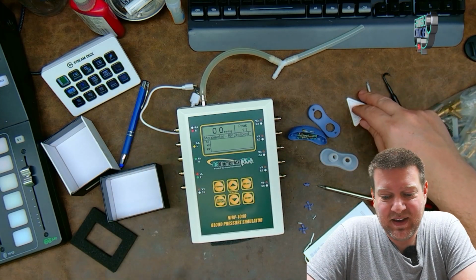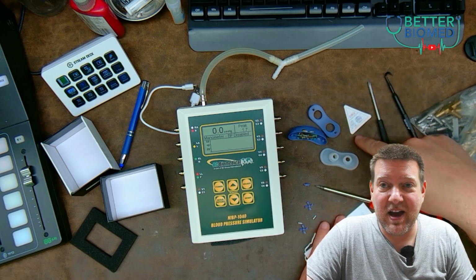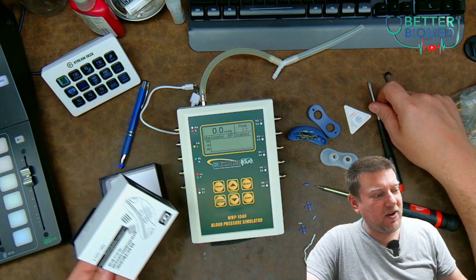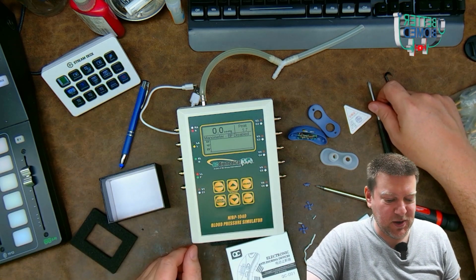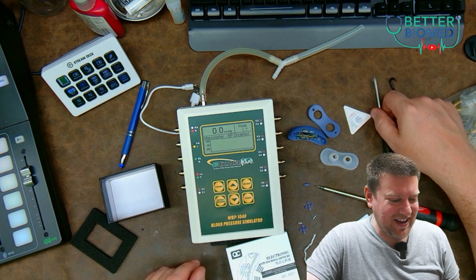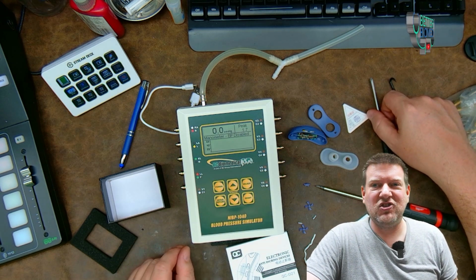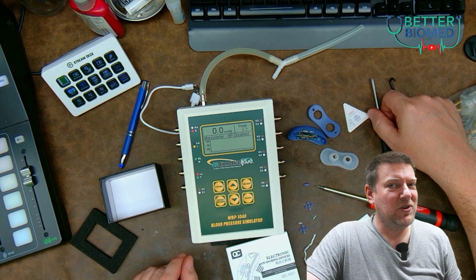So it is what it is, folks. But rest at ease, because it has passed quality control. Anyway, folks, there you have it. Absolute scam product. You see them. Have a good laugh. Don't buy it. This is the QC-001 QC. How ironic. QC is the brand. Quality control is the brand. There you have it. Oxygen concentration / CPAP anti-snoring device. You've seen it here, folks.